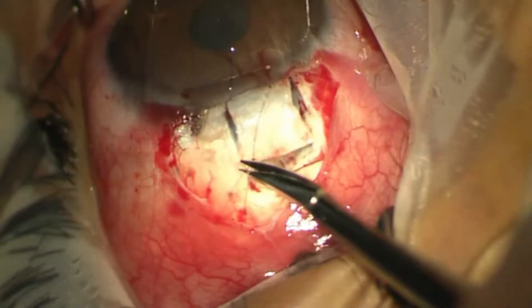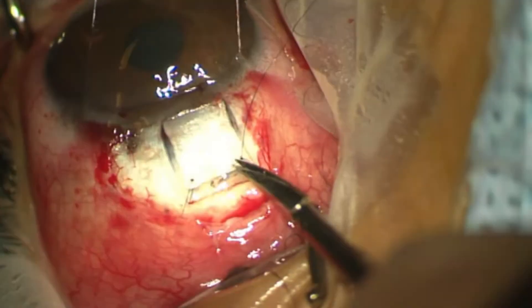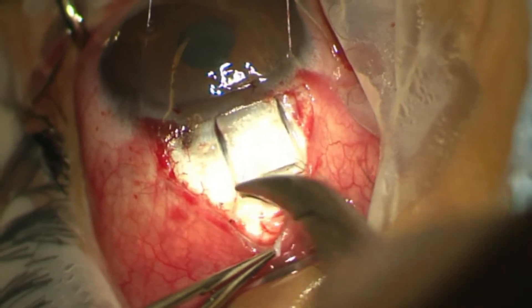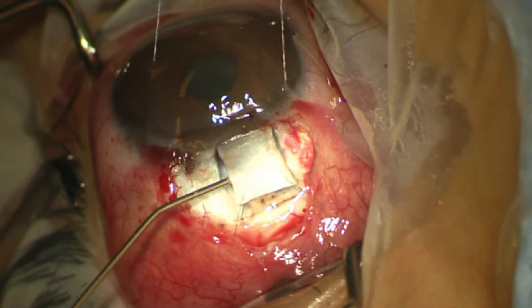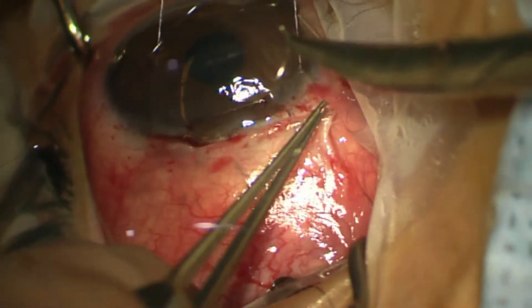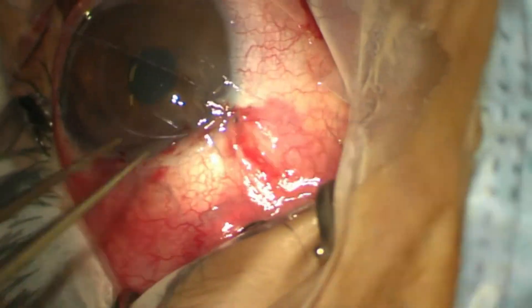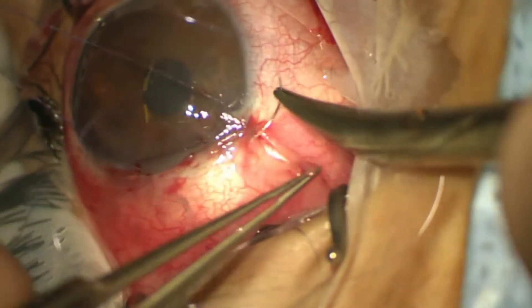We did not implant any space maintainer because in such a hyperactive child it is better to avoid implants, as there is always a risk of migration or dislocation during eye rubbing or activities. We then close the conjunctiva on one side with a running suture and one anchoring suture on the other side if needed.